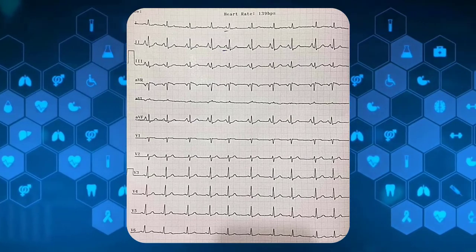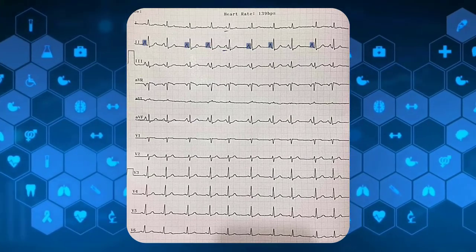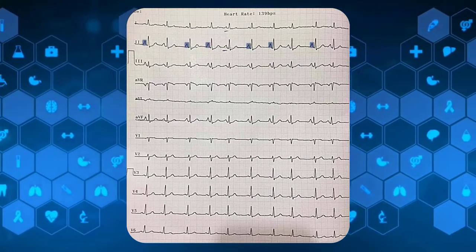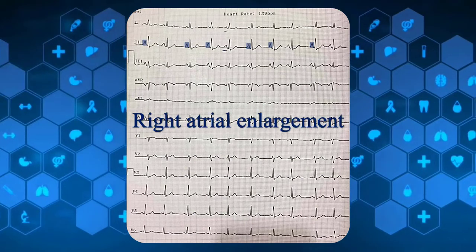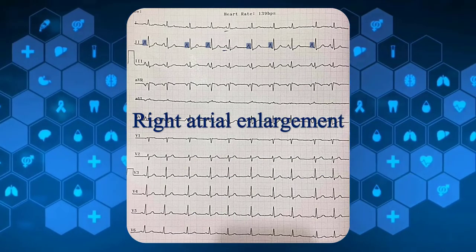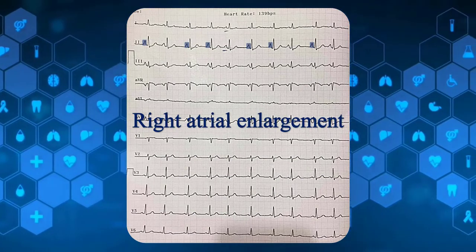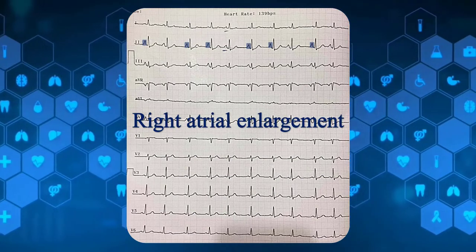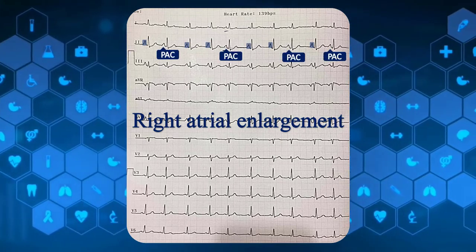Let's come back to our training strip. Here, P waves are obviously peaked and about 3 millimeters tall. Therefore, P pulmonale due to right atrial enlargement is present. The underlying irregularity is owing to PACs.